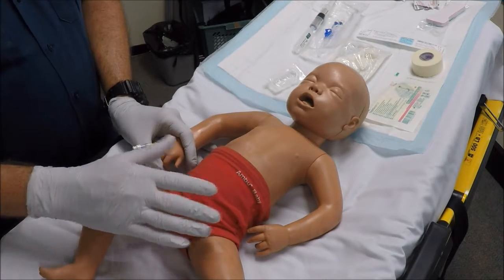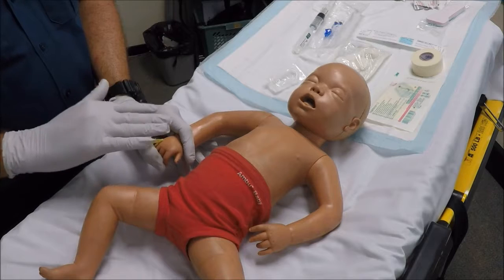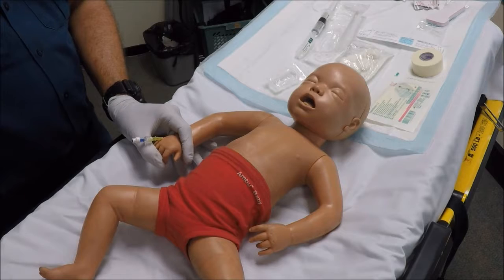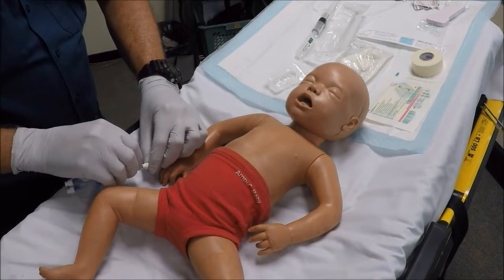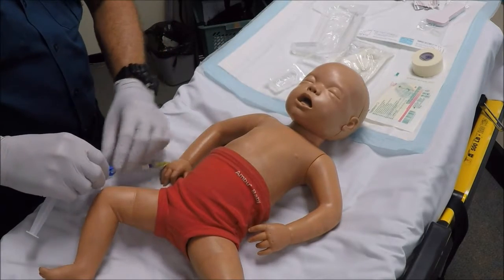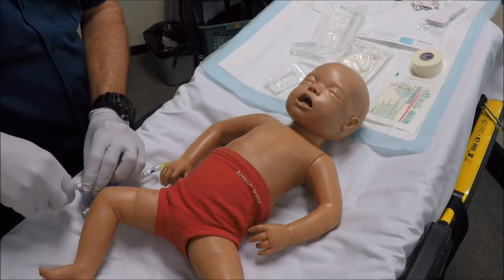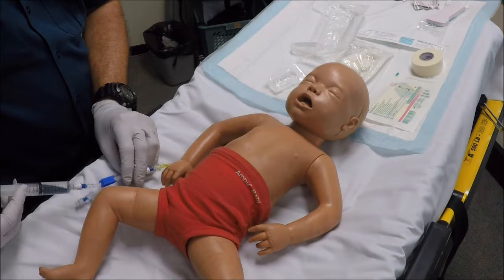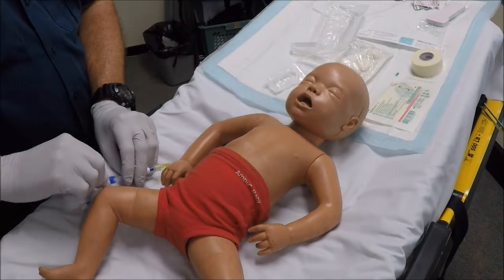Ideally we would have at least one other person to hold the patient's other limbs to minimise movement and reduce risk of injury to the patient's veins. Once we've successfully got flashback we can attach the extension line and flush with saline to ensure patency of the cannula. Ideally a second set of hands should hold the cannula so we don't occlude or kink it. Patency is confirmed.